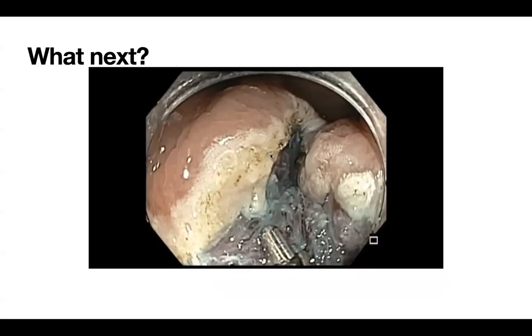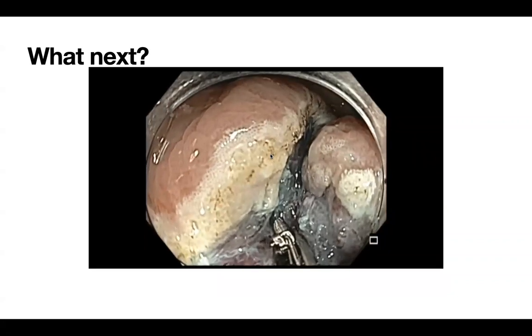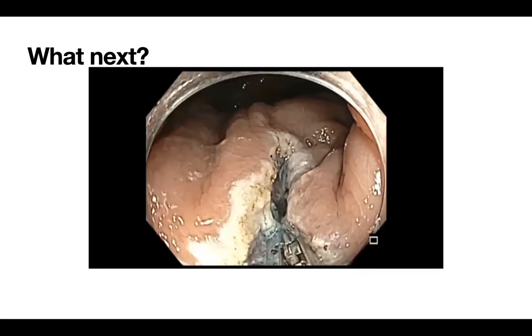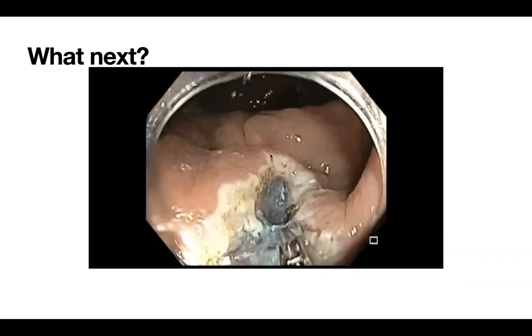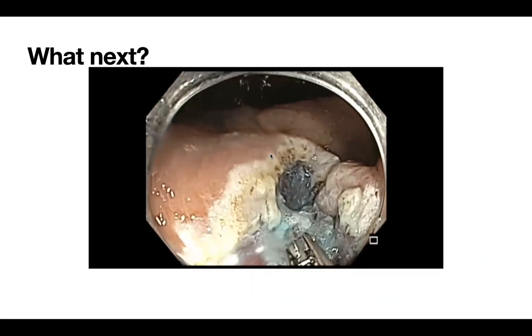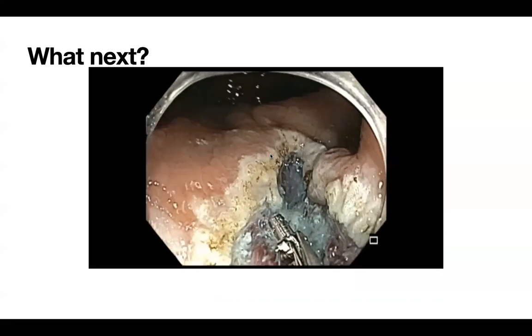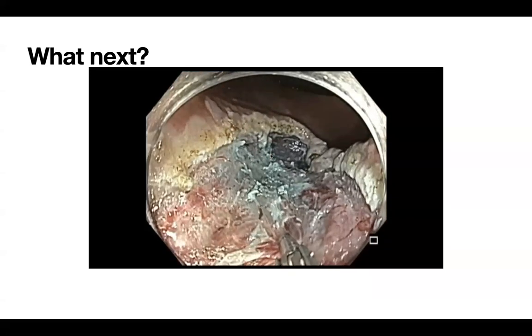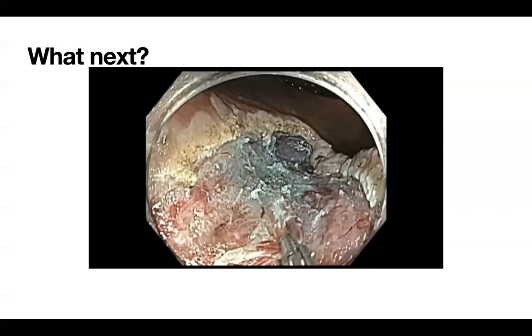So we used a hemostatic forceps. We used a soft coagulation effect, 80 watts. That's the setting that I used. And you probably could see what happens to the vessels when you use a hemostatic forceps. I thought that, okay, I'll take big vessels and try to coagulate.